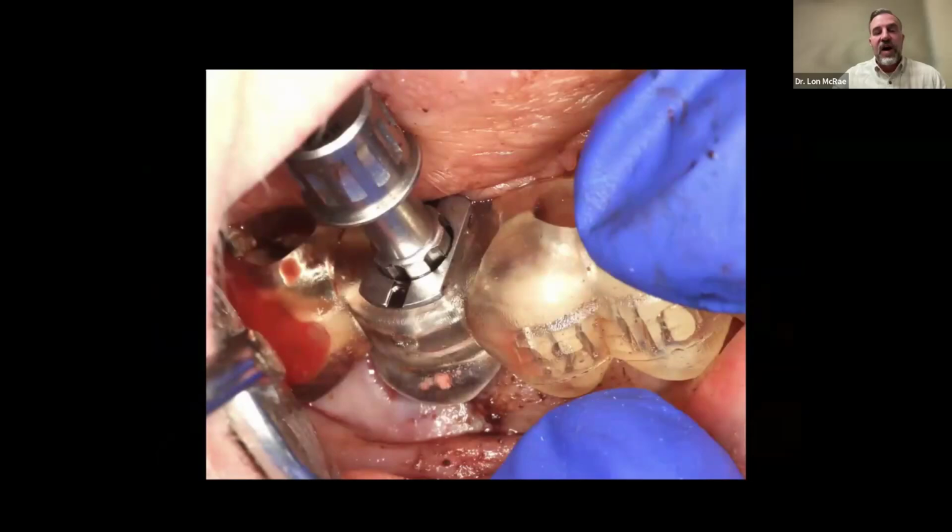So this is the driver. I can then make sure I've got 3 reference marks. I have the right reference point, the left reference point, and the big black area. All 3 need to line up. It also has a reference point of the black line.